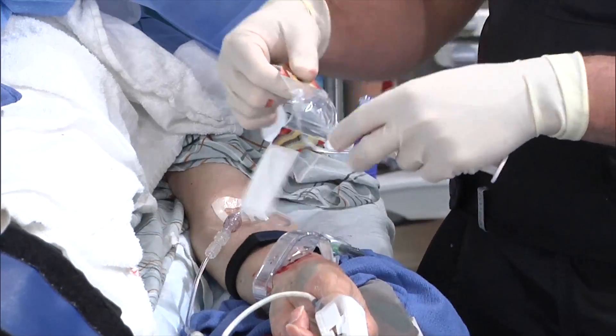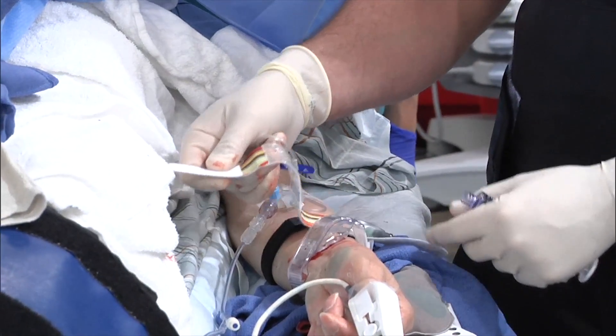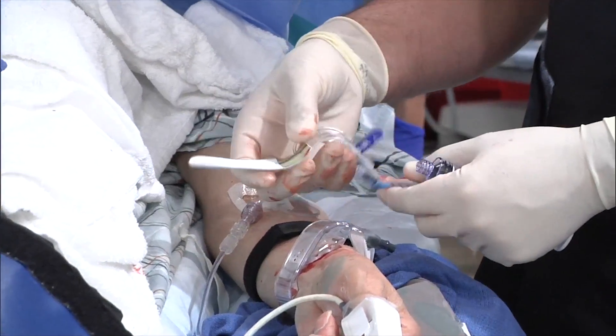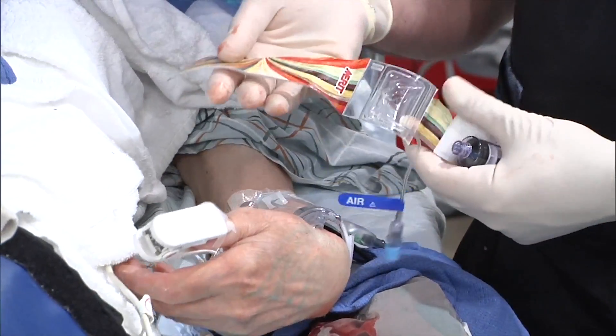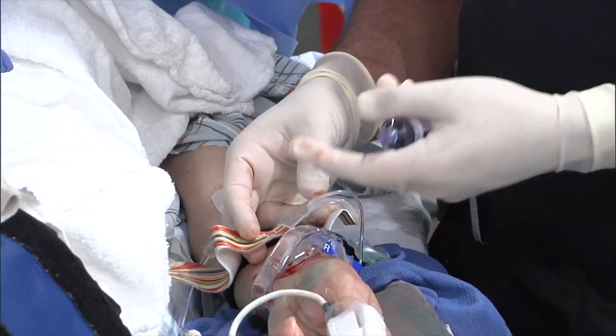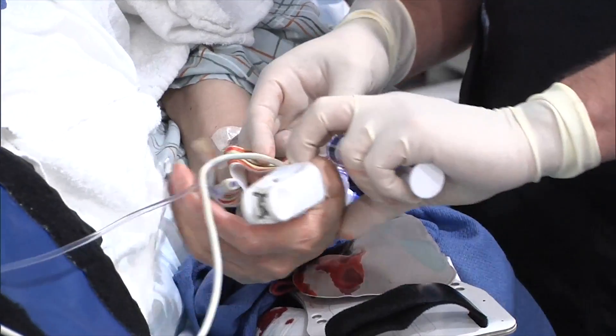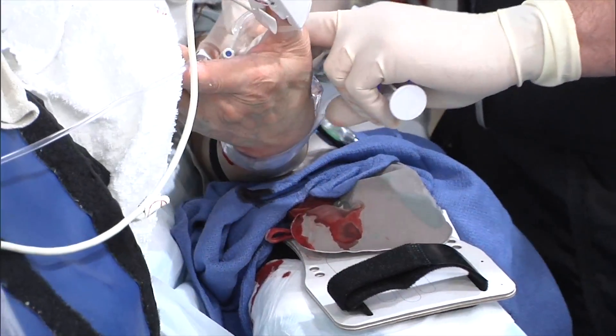This is a similar device which I wanted to show everybody. This just came out — this is the Prelude Sync. It's essentially a very similar device. It just has these different colors, probably more patient friendly. But other than that, it's basically the same thing. And you can see how he's moving his arm a bit — even with that, it's not bleeding or anything like that. So we'll leave this on for about an hour.